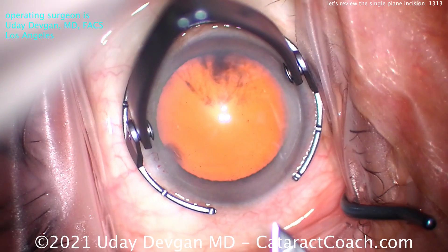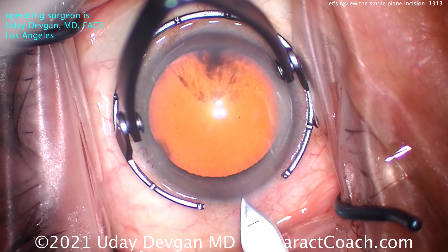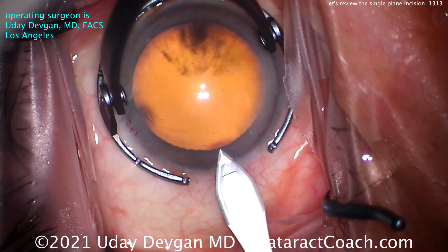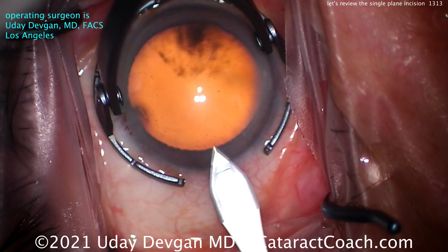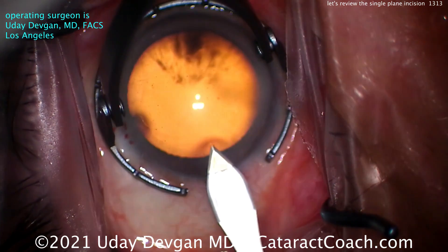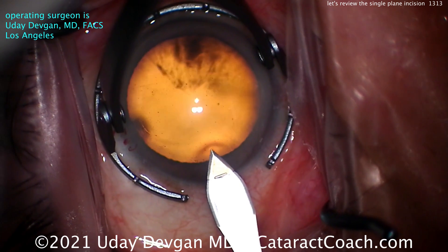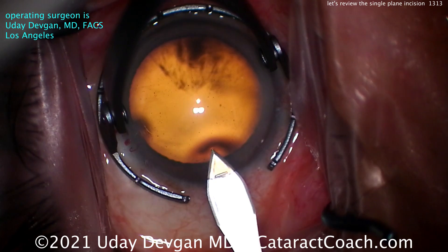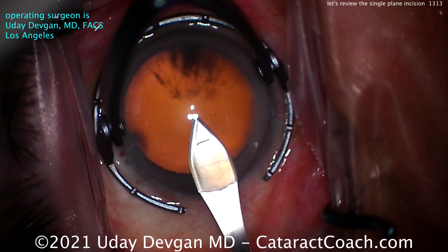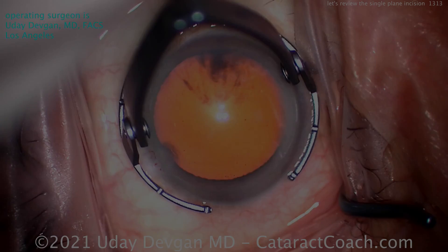Let's slow it down. The keratome is going to start right at the limbal vessels, and then we're going to make a single plane going in at exactly this angle. It's a very shallow angle between the blade and the conjunctiva. And you can see that little indentation there? That's where it's just about to pierce Descemet's. So now we can advance it some more — see how the cornea distorts.